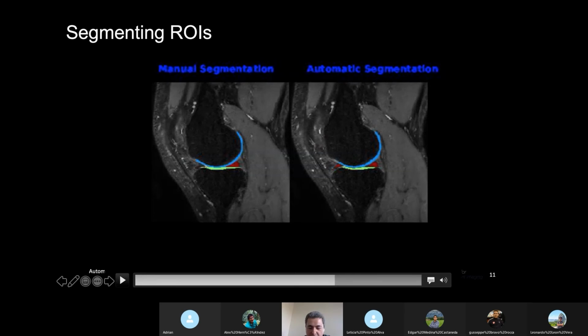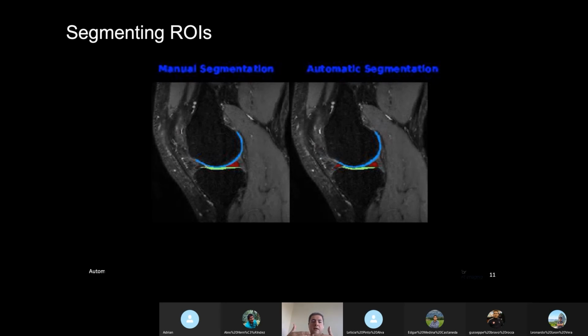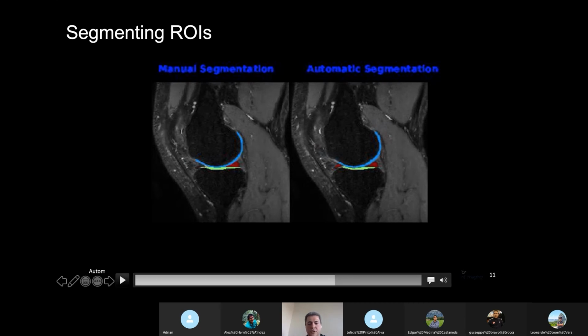Another difference, for example, here, the model detects the meniscus, and here the physician thought that this wasn't meniscus yet. But if you give it to another physician, they might think that, okay, this is meniscus. So it's very subjective at this point, especially when the structure starts and when it ends. So especially in the borders, on the peripheral slices, it's a more difficult problem. It's tricky.